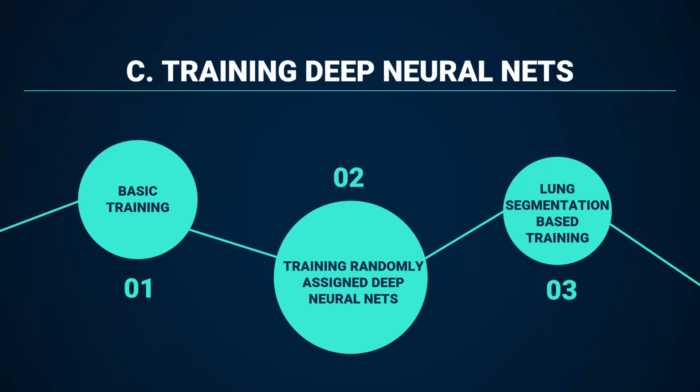Our hypothesis was that the higher the difference between them, the more likely the salience maps were generated according to our problem. Finally, so as to measure how non-lung areas of chest X-ray images change our salience maps, we trained a deep lung segmentation model and passed X-ray images to it.